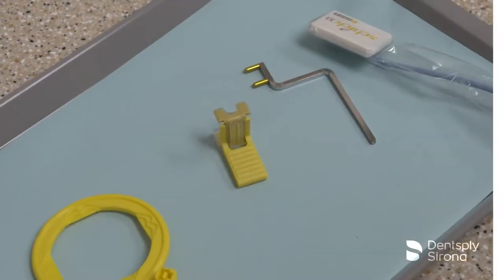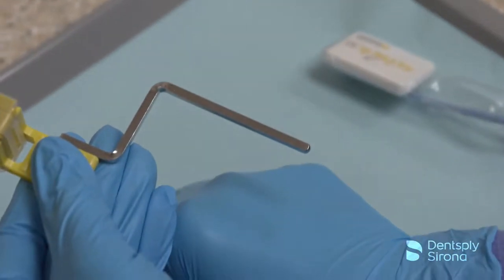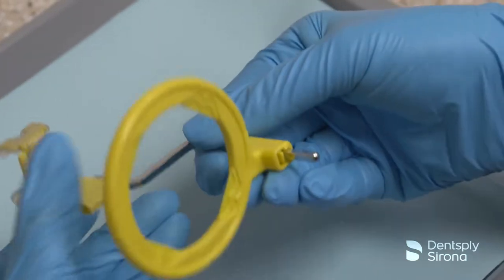To assemble the XCP short arm with XCP DS-FIT posterior bite block, place the yellow pins on the arm into the side of the yellow bite block and slide the arm into the yellow end on the aiming ring.